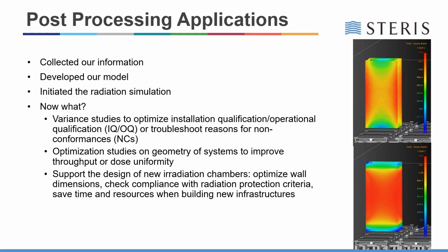And shown on the right, what we can see is variation of the scan width. The scan width for an accelerator can be changed, and the impact that that would have on dose uniformity is a process going through multiple tests and myriad dosimeter readings.